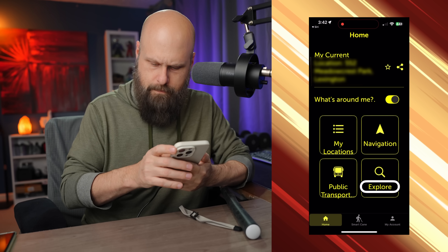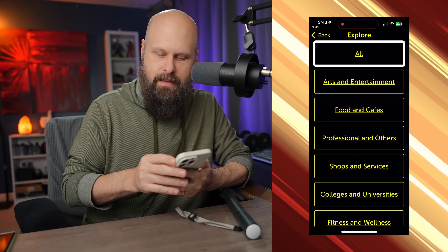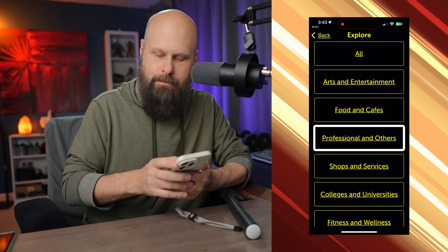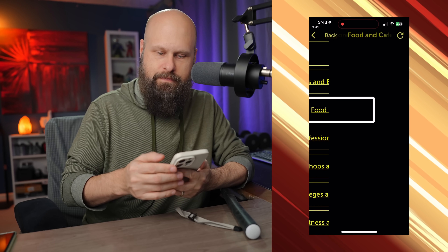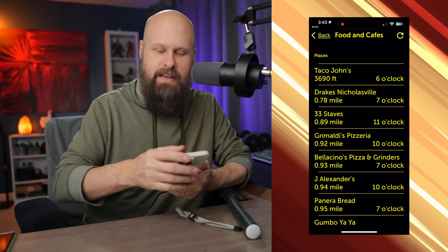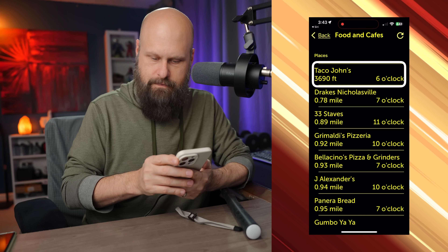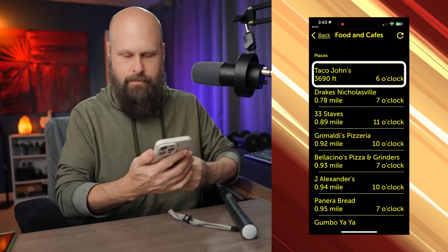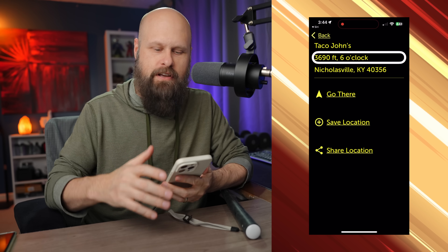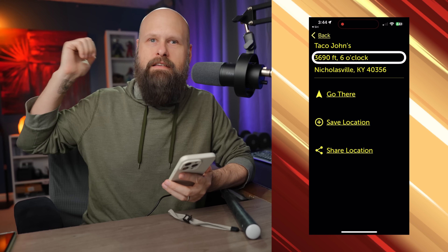Opening the Explore page shows a list of different categories: Arts and Entertainment, Food and Cafe, Professional and Others, Shops and Services. Let's check out Food and Cafes. This brings up a list of the places nearest to me with information, directions, and distance. For example, Taco John's at 3,690 feet. Double-tapping one of these items gives different options — it tells me how far away it is and what direction. In this case it's behind me, and yes, that's actually correct.